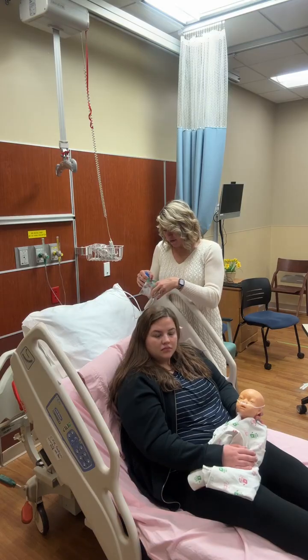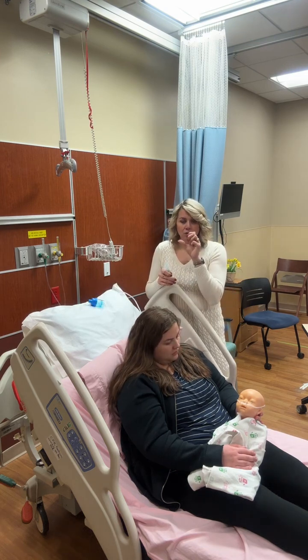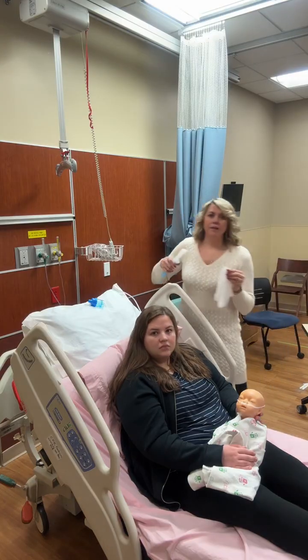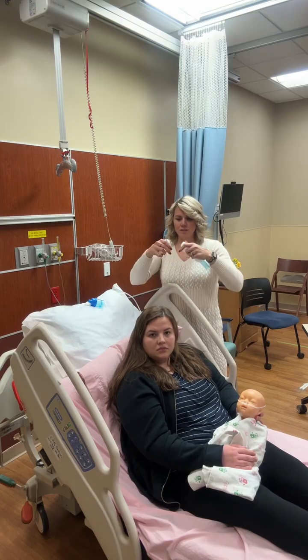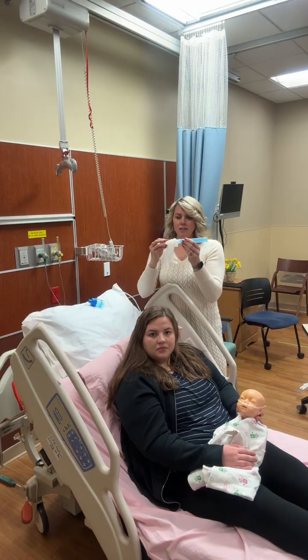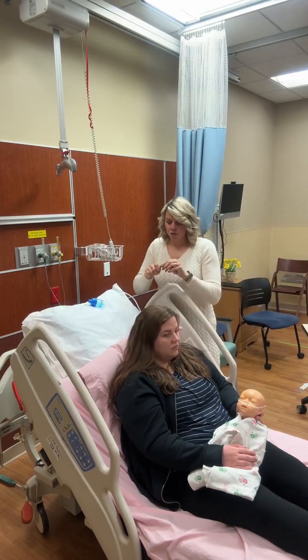So when you're going to give a medication to an infant or to a patient who cannot hold the mouthpiece and cannot wear a mask, we do what's called a blow-by. And to do a blow-by, you are going to take off the mouthpiece and you're going to stick on this fancy glove. And then you're going to connect it back like this. So now what we've done is we have just one exit point for the mist to come out of, all right?